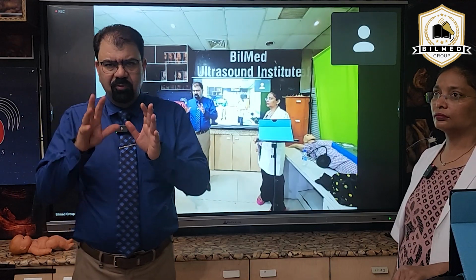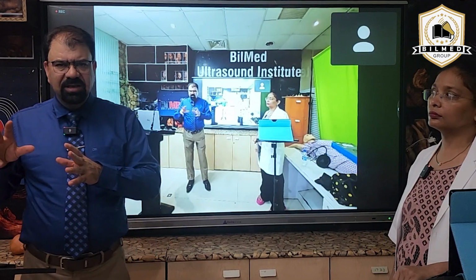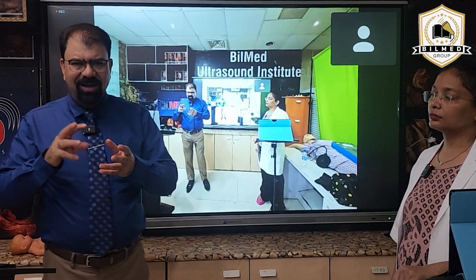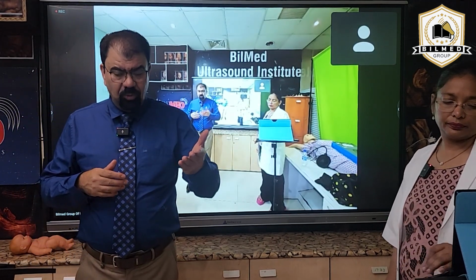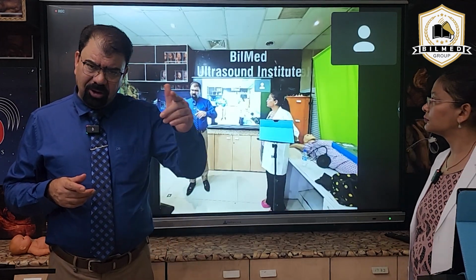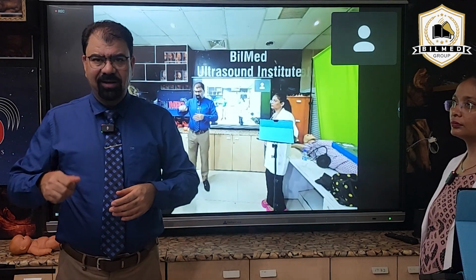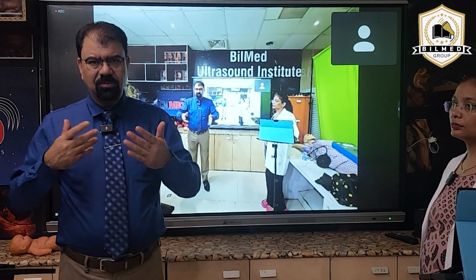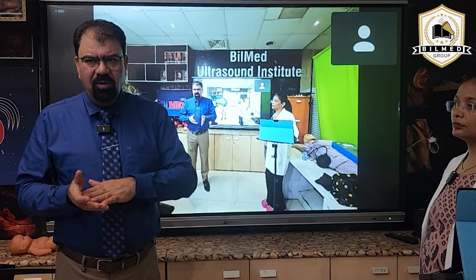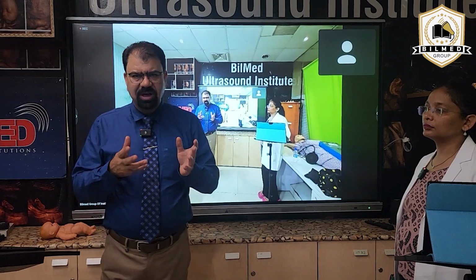And there's a saying, eyes can see what the mind knows only. If you know what this ICT is, what that is, then you will see on screen, yes, it was there. It is actually always there. This ICT is always seeing you when you are scanning, but you are not able to see it because your mind does not know it. Now, from tomorrow onwards, you will try to get this ICT in at least 10 patients.